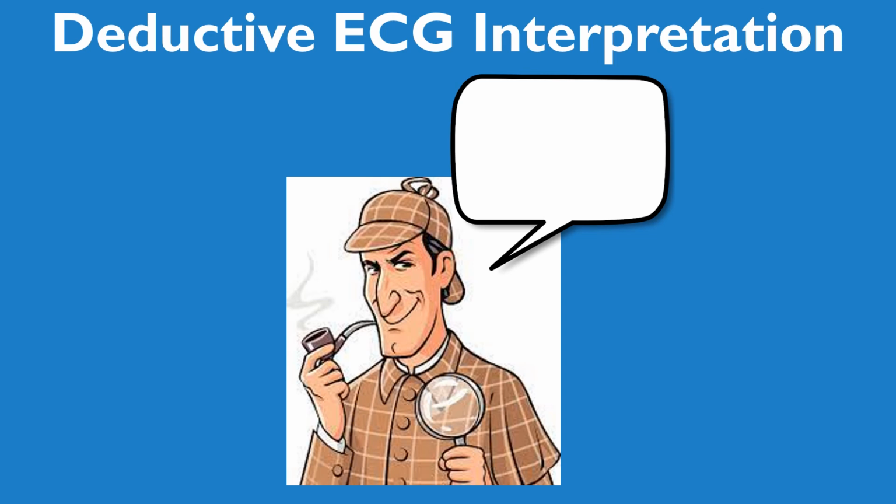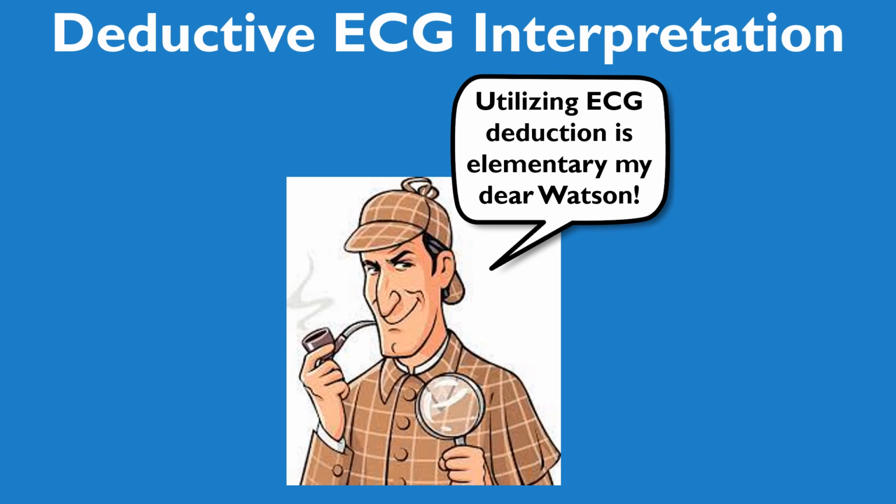The EKG Detective is dedicated to helping healthcare professionals make the transition from using inductive EKG interpretation skills to deductive EKG interpretation skills. If you're interested in finding out the differences between the two, I would encourage you to go back to the first video, where we spent a little bit of time talking about the differences between the two. But for this series, I am going to follow Sherlock Holmes's lead and tell you that once you use EKG deduction, it becomes elementary in the aspect that it is much easier to wield and utilize when you're trying to interpret what an ECG rhythm is.